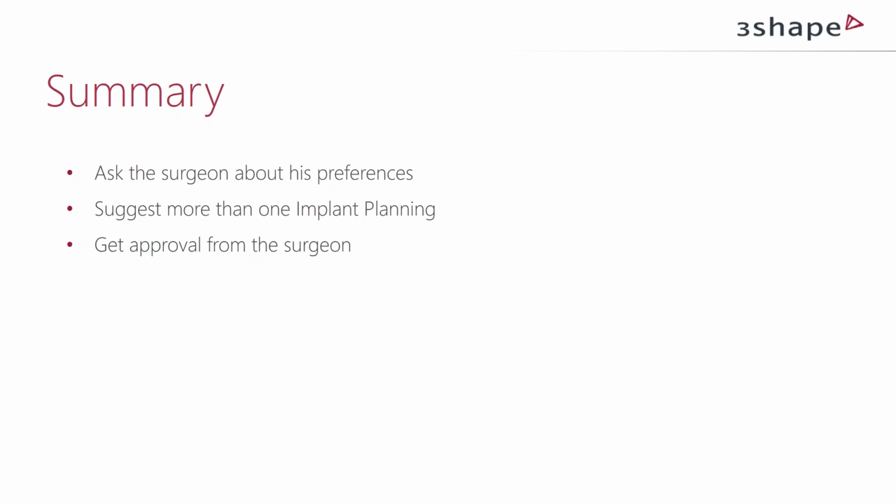And then there's a question in general on library updates. The way it works is that we work together with all these implant companies on making the libraries available to our users. Whenever we have an update or the implant company has an update, they inform us, and then we collaborate with them to incorporate the update, and then we release the library on a server that can then be downloaded from the software. So it's not like it is with Dental System where you are distributing files manually. Here we control everything, and you can access everything from the software itself, which is very nice.